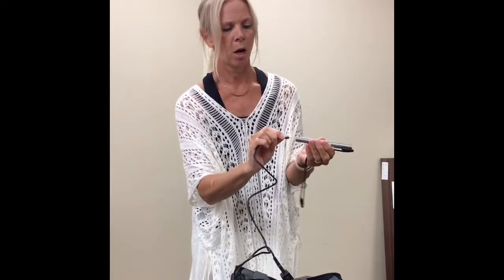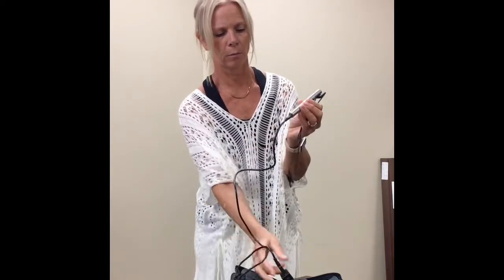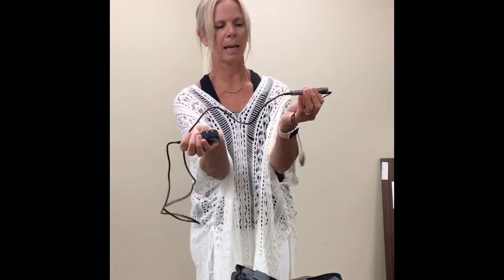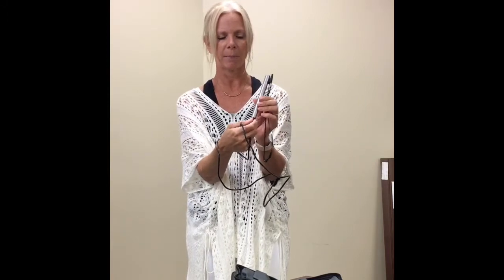Then to charge, I'm going to just plug the charger into the microphone, and plug that up, and an orange light will come on indicating that it is charging, and then the light does turn to green when it is fully charged. It will need to be charged every evening.